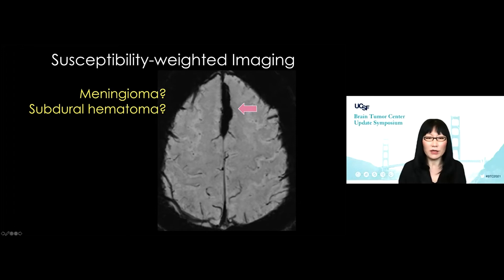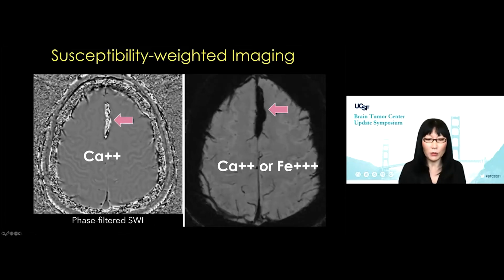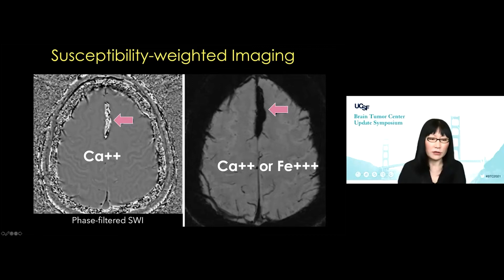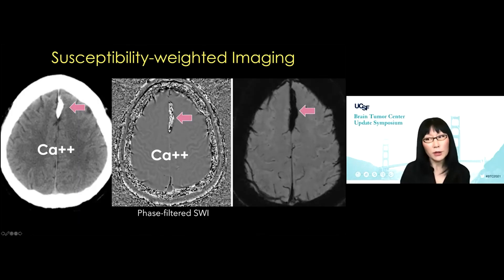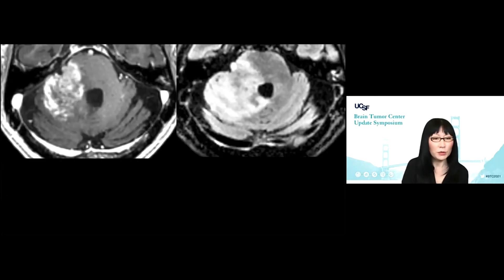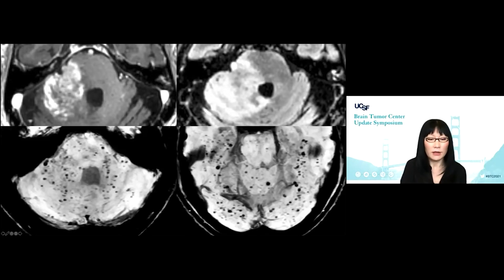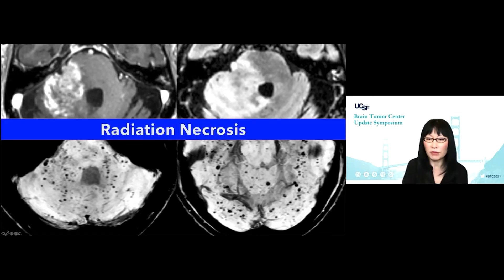Here's an example where susceptibility weighted imaging suggests either meningioma or subdural hematoma. But we can do a phase filter susceptibility weighted imaging that tells us calcium appears bright. So we know this is a benign dural calcification and not a meningioma, and not a blood-containing structure — we have CT to prove it. We really don't need CT to prove something is calcium anymore because now we have SWI. Here's a patient radiated multiple times for ependymoma with what looks like a very angry mass in the brainstem. Once you add susceptibility weighted imaging, these are numerous micro hemorrhages associated with radiation therapy — this is radiation necrosis.